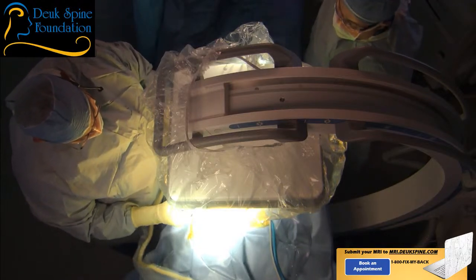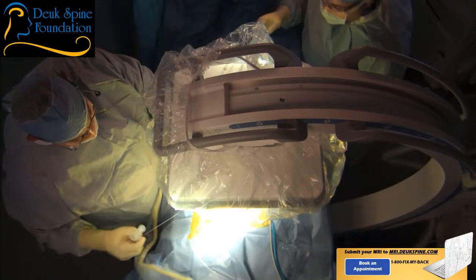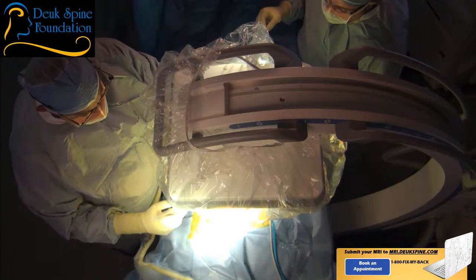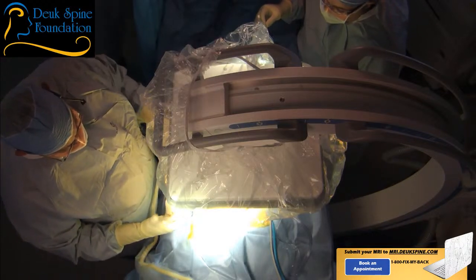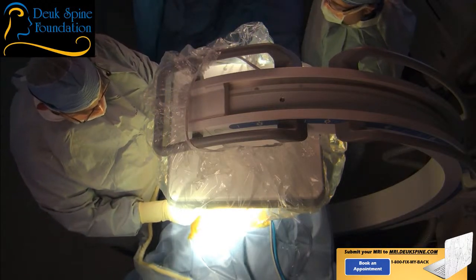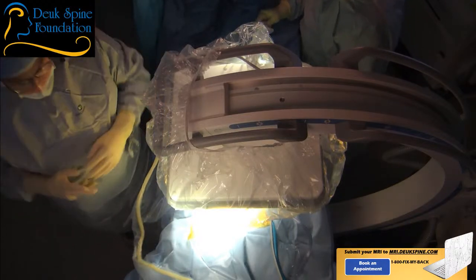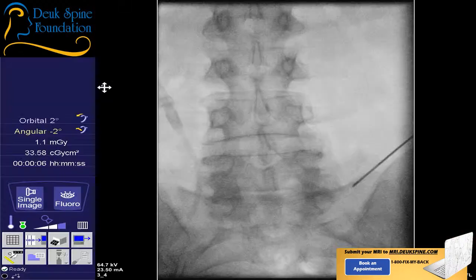You're doing great. That burning in your arm is just the propofol medicine usually going in your IV, so don't worry about that. That's normal. I'm Dr. Deukmedjian. We're going to get started here. I'm giving you some more numbing medicine, okay? Try to make you more comfortable. That should be not in my way, but let's get a shot. Let's go lateral. You're doing great. Everything is okay. I need you awake so you can help me in the beginning.